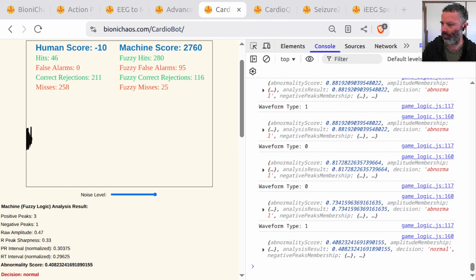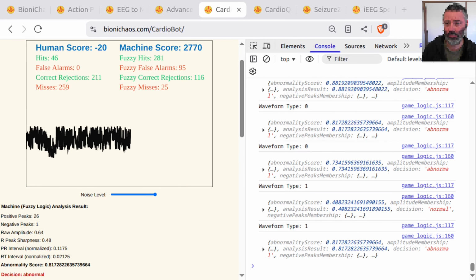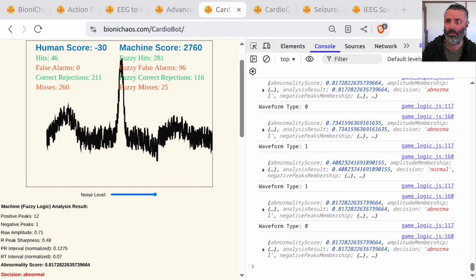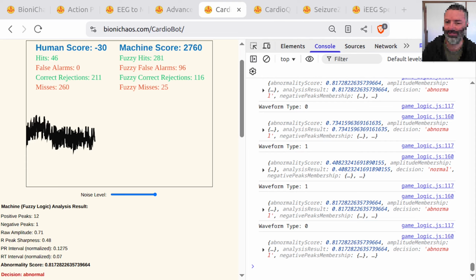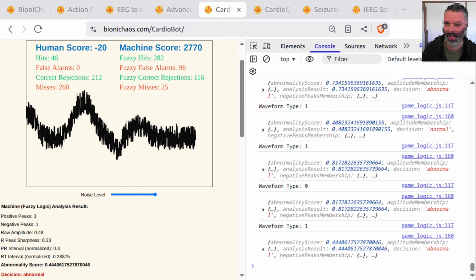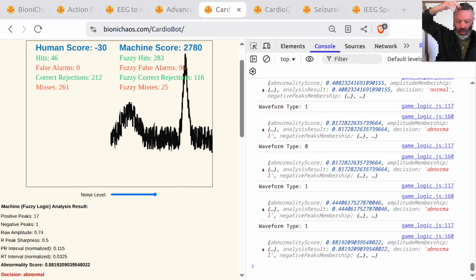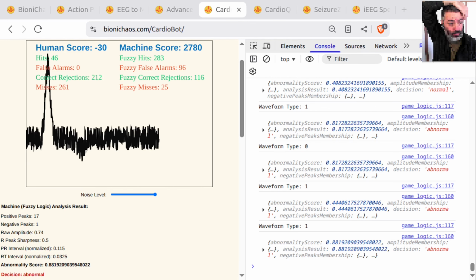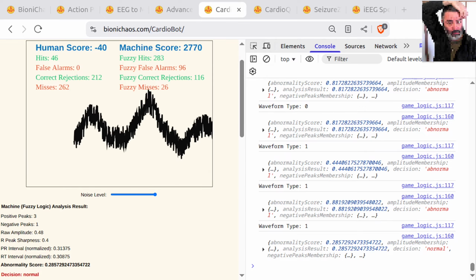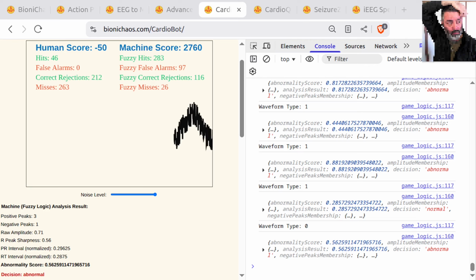For tachycardia, generally defined as above 100 BPM, you might have a rule like IF heart rate is high, THEN the ECG suggests tachycardia. The strength of the tachycardia conclusion would depend on how strongly the heart rate is high. It's not a hard cutoff. A rate of 101 BPM triggers the rule partially, whereas 150 BPM triggers it strongly. That nuanced assessment is the key. You can layer in other features, P-wave visibility, QRS morphology, to refine the diagnosis.